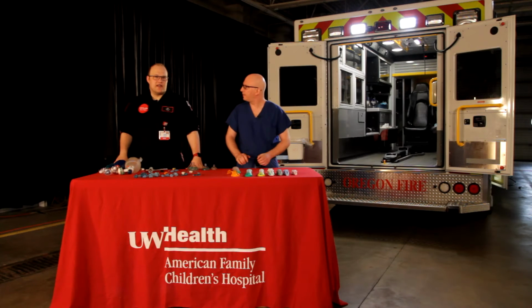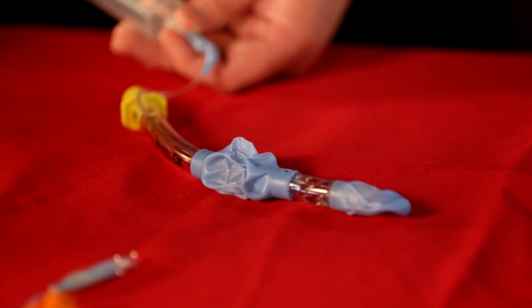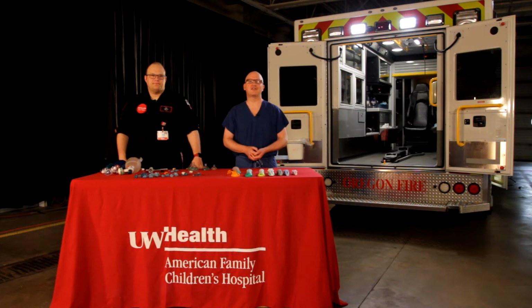And one of the things that we also say is, thankfully this is a fairly rare event in EMS that we have to secure a child's airway or ventilate through a bag mask or a supraglottic tube. So it's one of those things that you want muscle memory. So I highly recommend getting out and putting hands on these devices and trying them in a variety of mannequins and situations, because they are a little bit cumbersome the first few times you do them. And if you don't have the muscle memory, it's an easy skill to forget. Why don't you and I go and do that right now, and we'll show you how you can be sure that these things are in the right place.